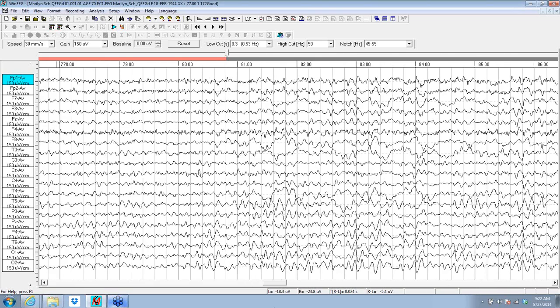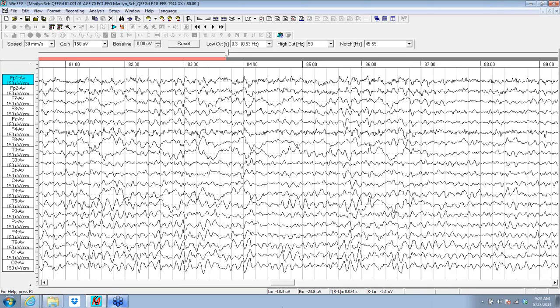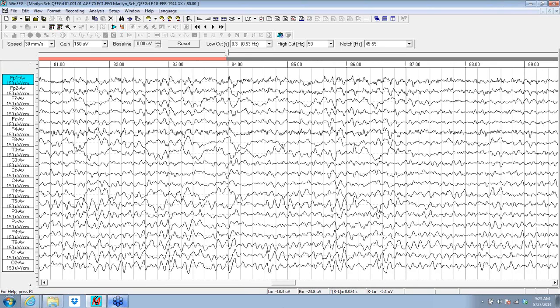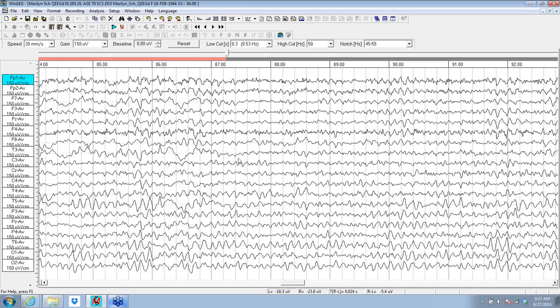Sometimes they've got their blood pressure controlled excessively and they're hypotensive. But whatever's going on is creating intermittent temporal slowing. If this was continuous, we'd say it's a white matter problem, but you can see it's there and then it's not. The temporal lobe basically doesn't have that slowing now, and it does over here. So this is a large field slow wave running through the temporal areas.